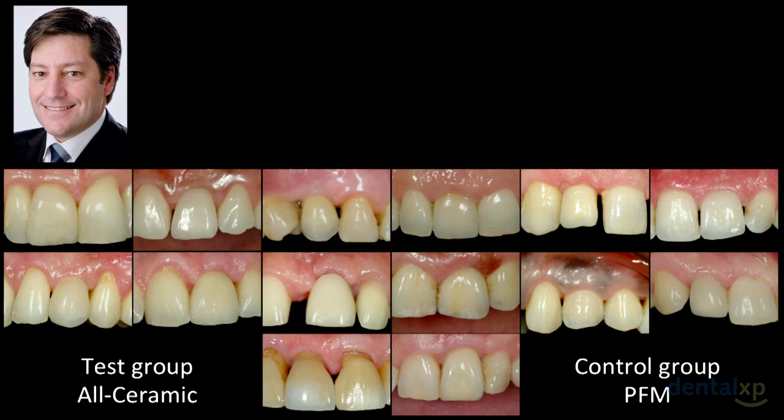23.29%. That is a little bit much better. Now, this is what we did on this test. Besides measuring all the objective parameters, we asked the clinicians, can you really see the difference? These patients were randomized in a way that the patient was assigned to a group, but we didn't know what crown we would be delivering until we took final impressions and opened the randomization envelope. So we could not really assign the patient to one side or the other.